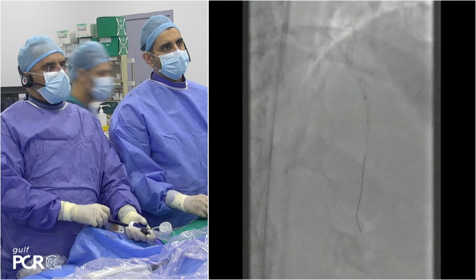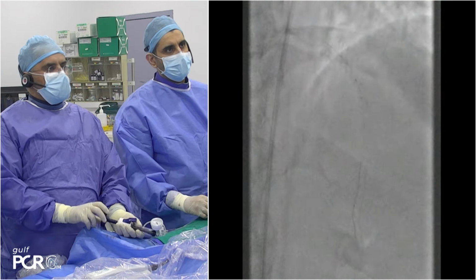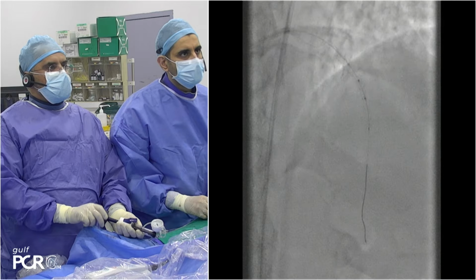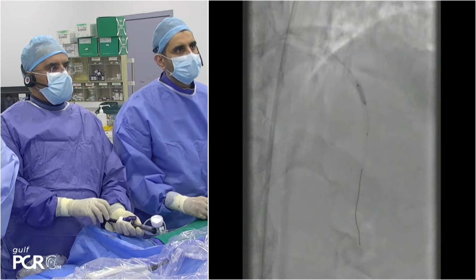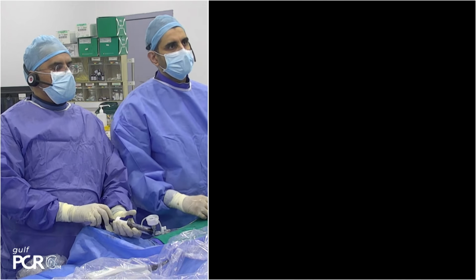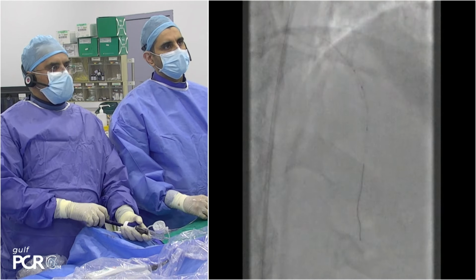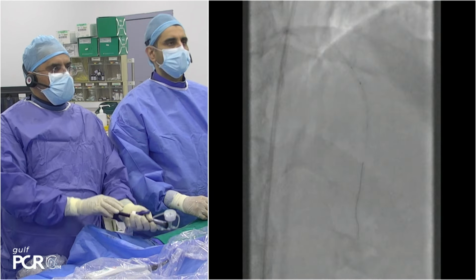I agree with you, but do you believe in 80% or 90% from the area? What's your definition of well-expanded distal? It depends on the type of the plaque you have behind. If you have a soft plaque, you must reach 90%. If you have a calcified plaque, 80% could be enough.